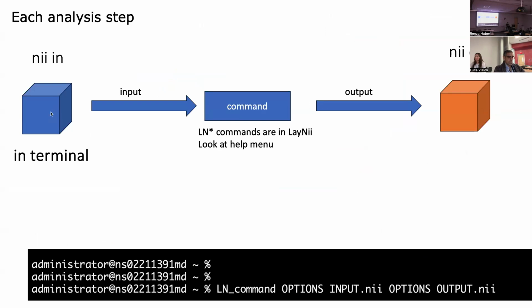So the niche is that it's NIfTI in, NIfTI out. It's a program that usually starts with ln. You have some options, input and output. And we will do that. Maybe just to get a bit of a feeling of what I should prepare tomorrow: who has worked on a terminal before, typing in commands?